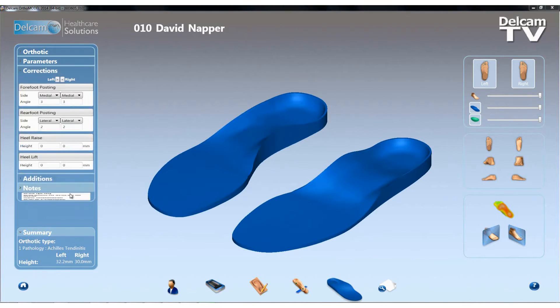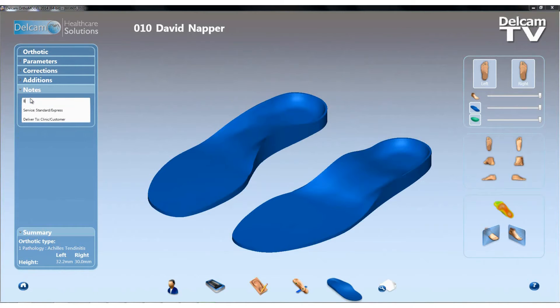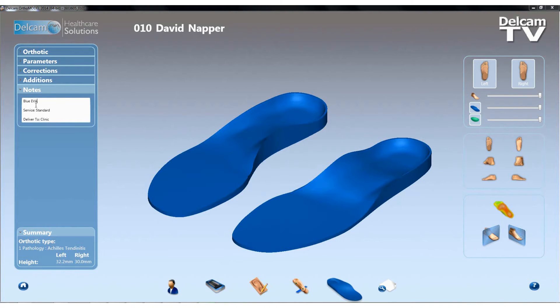Moving down the options, we have a completely new section that's been added to the design page, which is the notes section. This allows me to enter any text that I want to be recorded with this particular order. In this case, I could specify that I want this to be blue EVA. We can also change the service level — so let's say standard service and we want this delivered directly to the clinic. We can have some text which is already pre-loaded in the notes field. That's completely configurable and you can add as many additional notes as you want, and all that information is stored in the order.